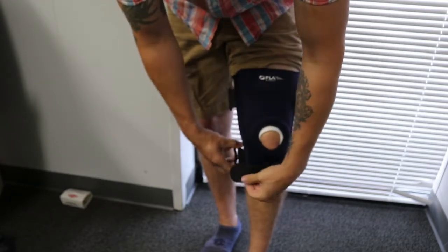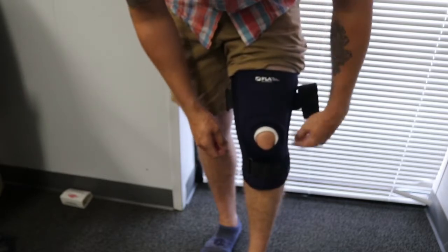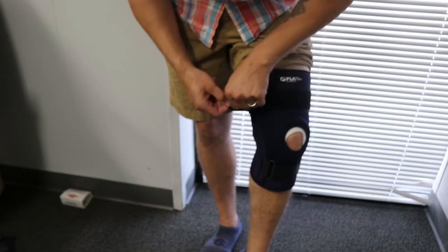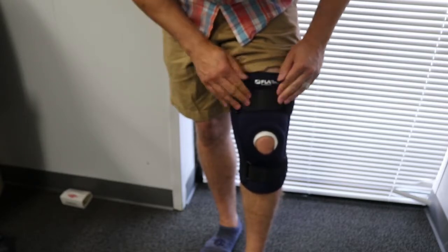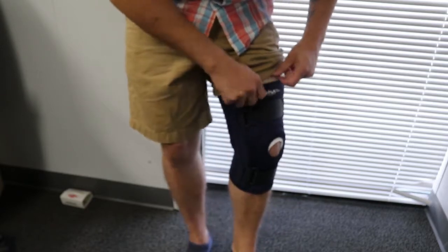Once you have the placement of the insert, slide the support up over the knee. In my experience, pulling the brace just above where you want it and adjusting the straps down at that point is useful, as when you start to walk the brace will naturally slide down the leg and fall into place right where you want it.